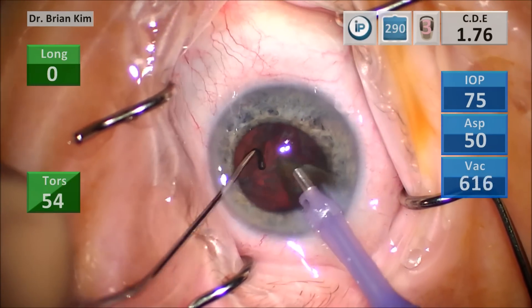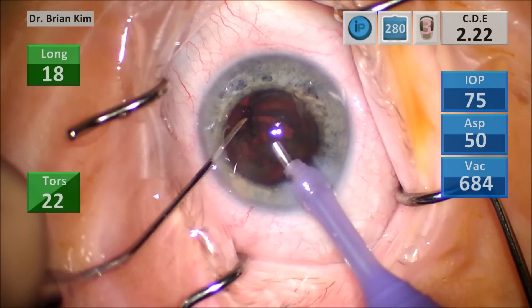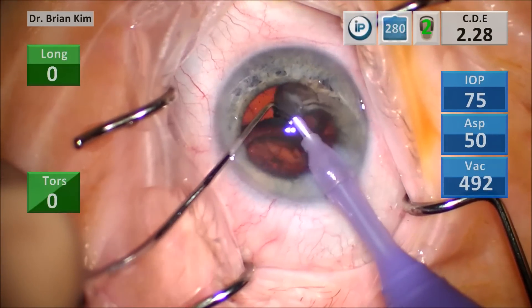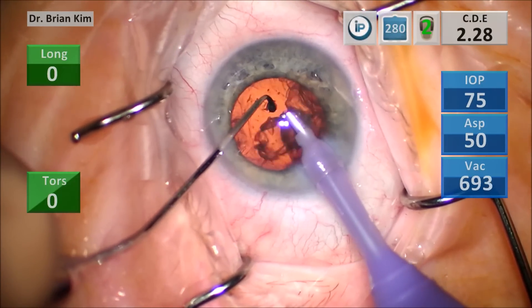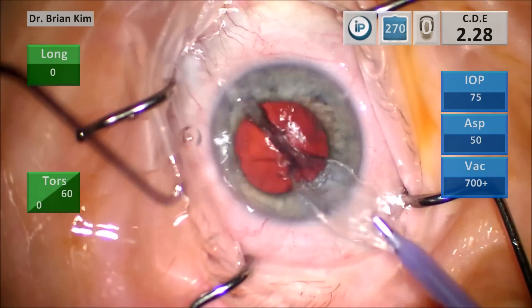By not using Faco energy during those critical steps, and not applying any vacuum during those critical steps, I'm able to provide — in my opinion — safer surgery: less risk to the posterior capsule, less risk to the cornea, and less opportunity to inadvertently grab the iris or the capsule.